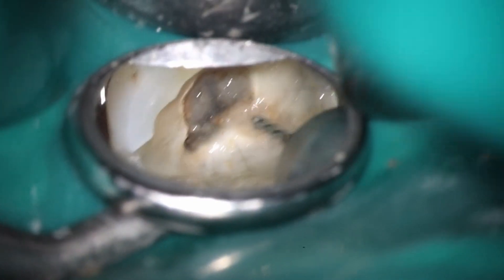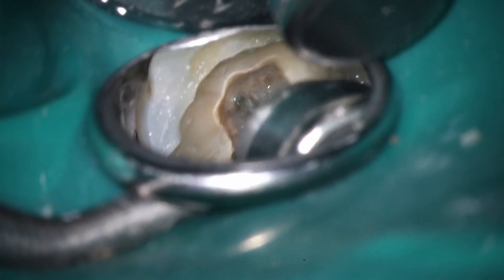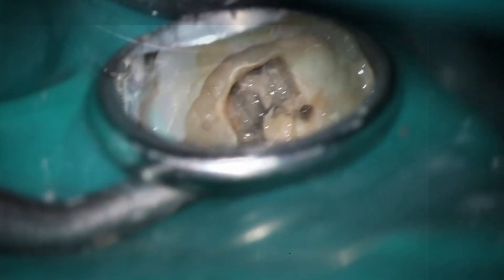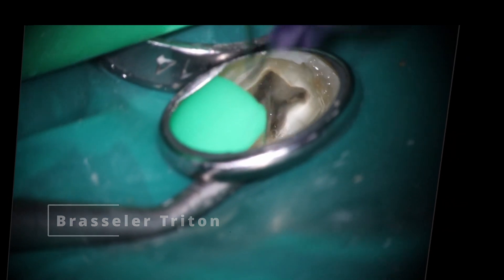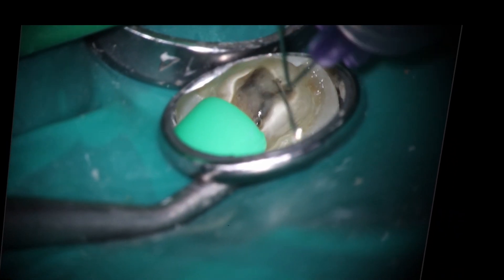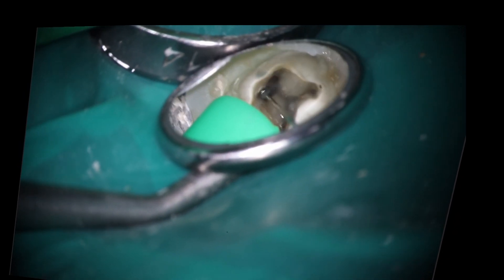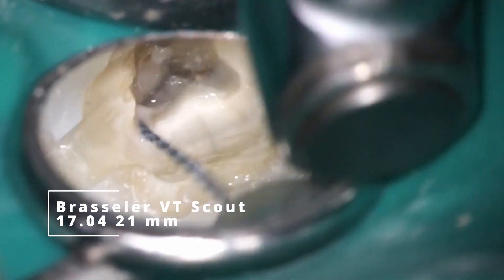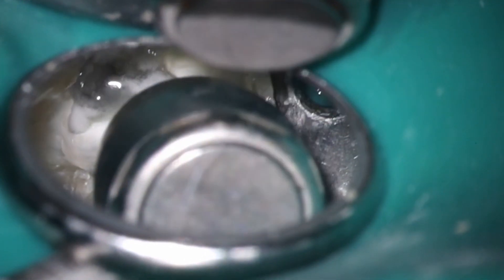You can see the kind of nasty drainage. I wasn't sure if we were going to be able to finish it at this point. Anytime I see drainage at the beginning, it usually makes me a little concerned. What you'll find on cases that are really nasty is that as you get down to the apex, there's actually more drainage coming out — almost like you open up and all that pressure gets released. A lot more rinsing than normal here because of the infection. Going down now with a 17 — you can see those bubbles — so definitely some bacterial activity is present.